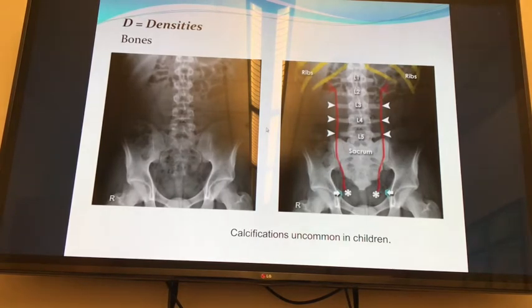And this is something, again, before ultrasound, and more with adults, where you see someone you might think has renal colic, just to appreciate where the pelvises of the kidneys and the ureters are. The ureters run right along the border of the transverse processes of the vertebrae. So if you're looking for stones, you can look down along there and just by the SI joints to see a little white thing that might be a stone. You make the diagnosis here. There's a, no, I don't think that is, but that's where you would see it. So again, rare to see, but that's where you look for them.